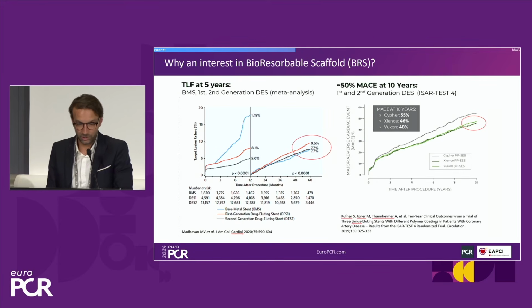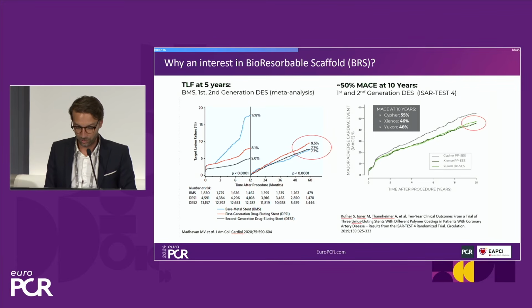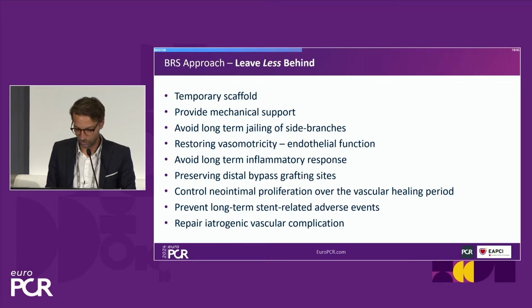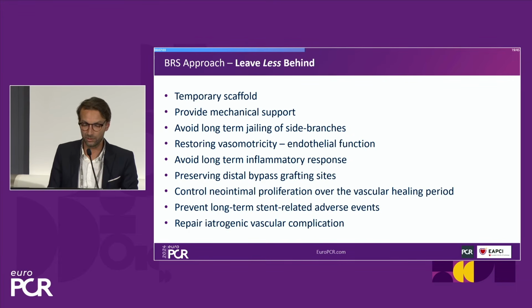So why are we interested in bioresorbable scaffolds? Because stents were a revolution in the past, but they are still responsible for stent-related events, with an increase over the years. And for the last 30 years, we've been interested in the bioresorbable scaffold and leave-less-behind strategy. The idea is to have a temporary scaffold that provides mechanical support during vessel healing, to preserve distal bypass grafting sites in case of disease progression, and prevent long-term stent-related events.